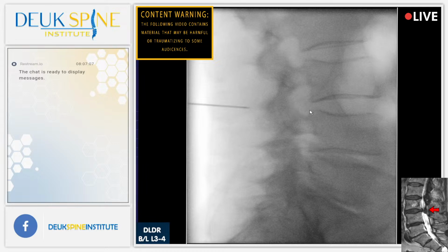And where does the nerve actually come out? It comes out at the top, just under the pedicle. Show us the pedicle of L3. That's correct. The nerve coming out of the spine right there is the L3 nerve root. And the L4 nerve root comes out below that. There you go. Perfect. So the L4 nerve root is passing by the back of the disc on its way to exit. Yep, and that's where the herniation is.